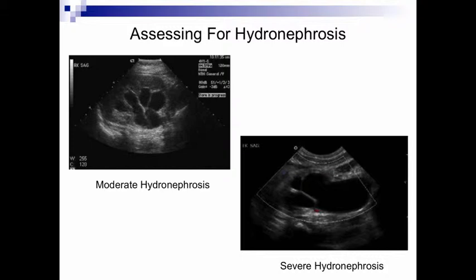And with the renal cysts, as long as they're not parapelvic, meaning that they're very close to the renal pelvis in terms of location, you'll find that the renal cyst is probably mostly cortical based and mostly peripheral, at least in some of the cuts you'll obtain, and that may help you identify a renal cyst.